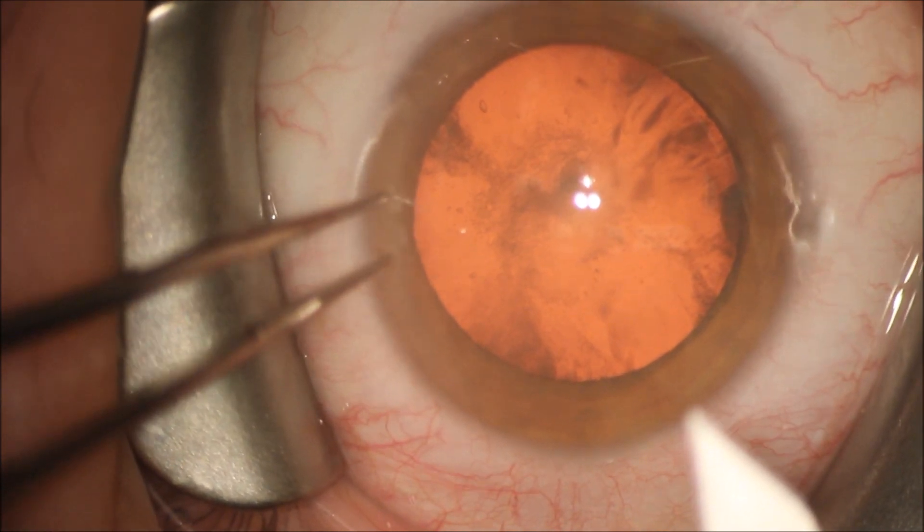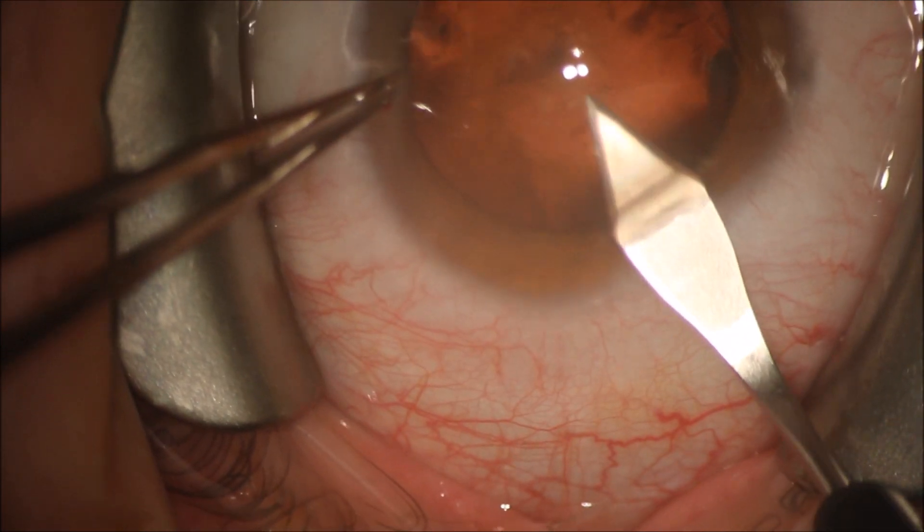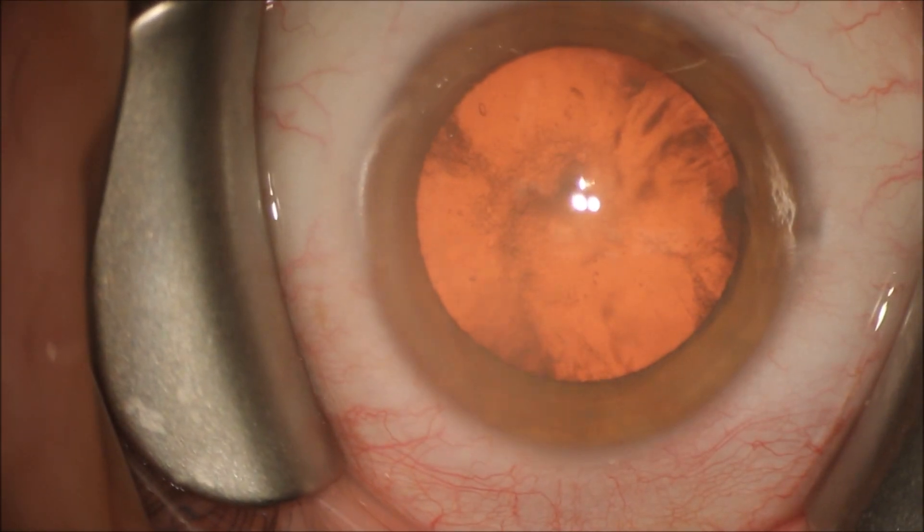We made our normal superior side port incision with a 15-degree blade. We're going to use a 2.8 millimeter keratome to make our main incision.